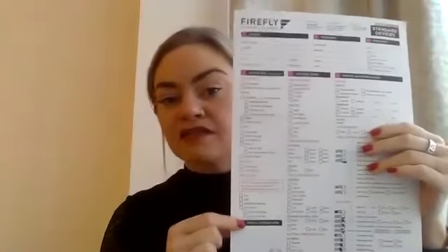So when it comes to choosing your device type, basically what you're trying to do, assuming that the foot will tolerate correction, is choose a design that's going to best fit in their shoe. So there's a couple of things that differentiate between the device types. You'll see here, that's the section where you choose your device type, and you will get a list of all of the specs within the catalogue. They come in the same order also.